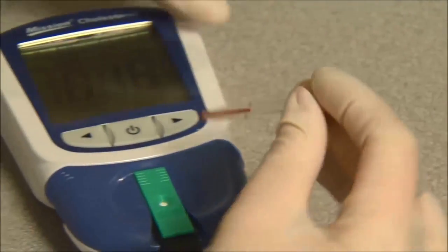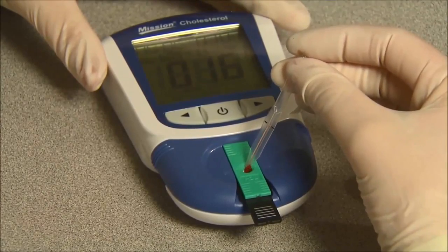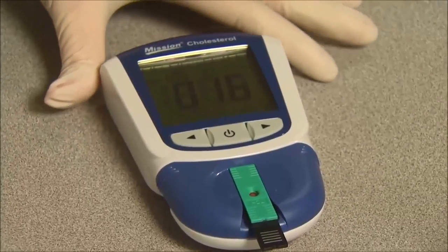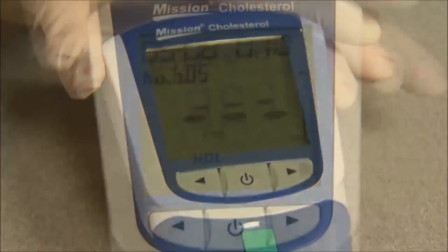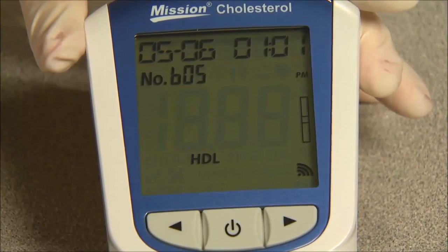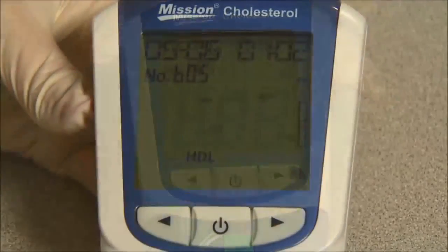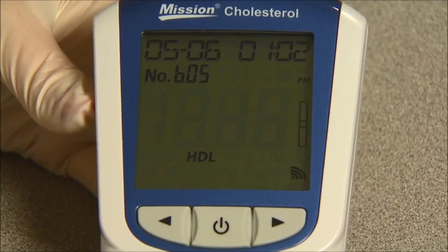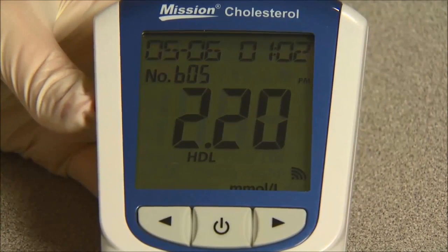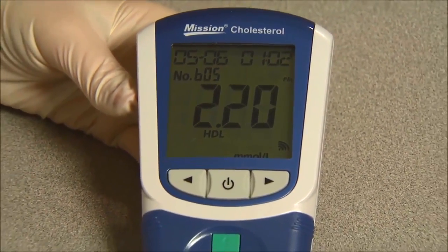Apply the blood sample to the center region of the specimen application area of the test device. The meter will begin testing automatically, with three dashes in a line flashing on the display indicating the test is in progress. Results will be displayed in 45 to 120 seconds. The meter will automatically turn off after five minutes of inactivity or when the power button is pressed.